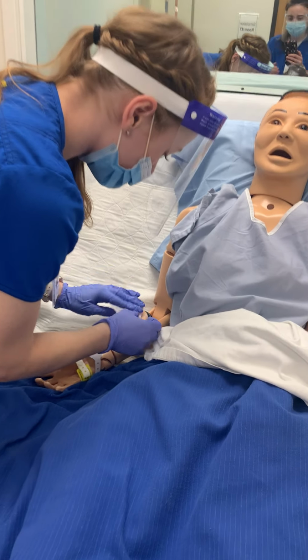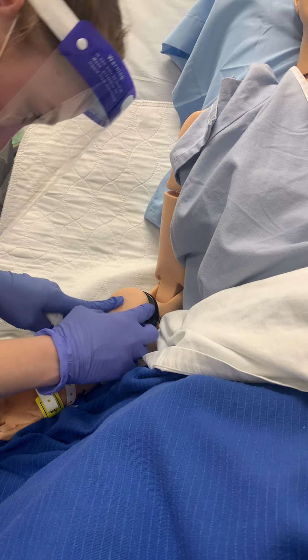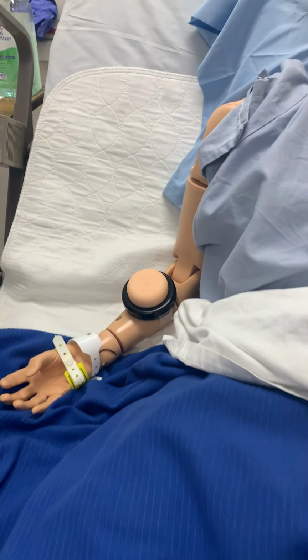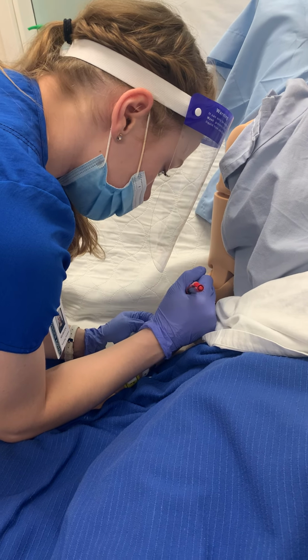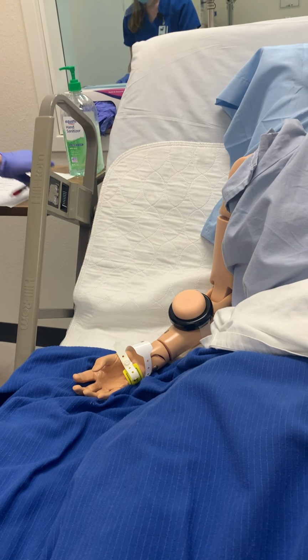And then I would hold, but I wouldn't massage because this is a Z-track, so you don't. You still doing good, Shirley? Okay, cool. And then as you can see, it's kind of faint because of the marking we make, but it's right there. So then, Shirley, what I'm going to do is I'm going to circle this, and I'm going to put my initials and date and time. Okay, perfect, Shirley. Are you still doing good?